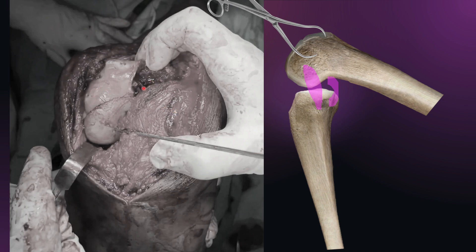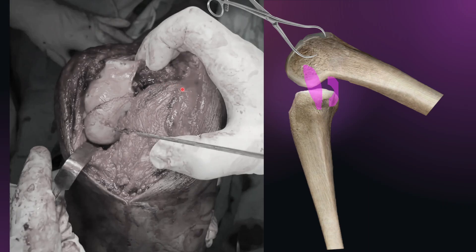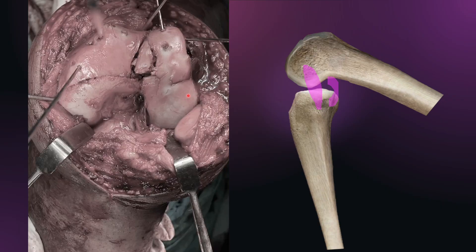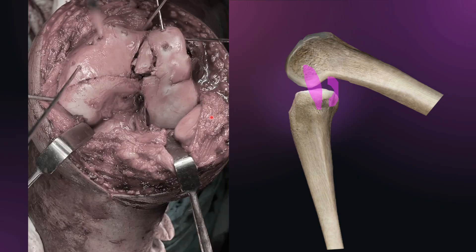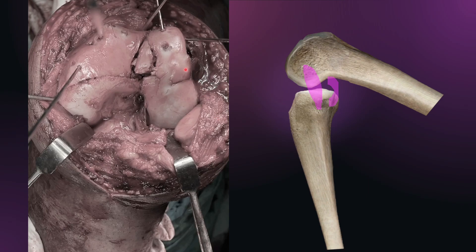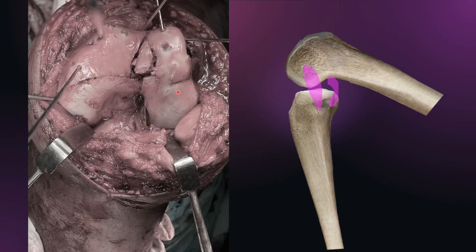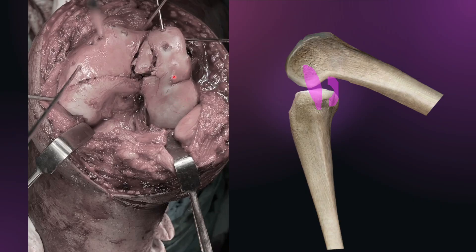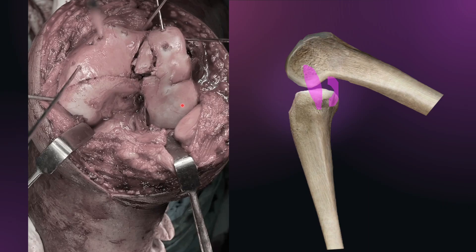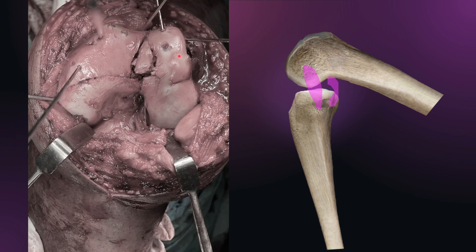This is the patella. If we want to see more of the other condyle, we can simply retract the patella more toward the lateral side. Here we have used the medial parapatellar approach, and we can retract the patella or patellar tendon laterally to expose the lateral condyle as well. You can simply retract the patella more laterally and you will be able to see the lateral condyle. The same maneuvers can be performed to expose the posterior part of the condyle, and you can reduce it by doing the anterior drawer maneuver. Once length is restored, place multiple K-wires and create an articular block under direct vision.